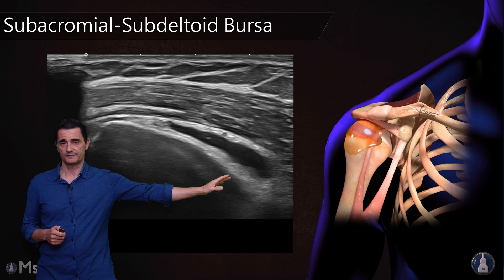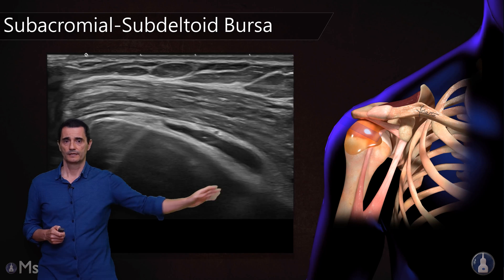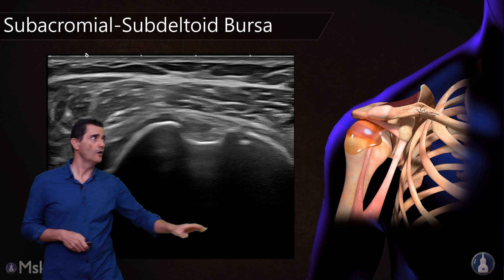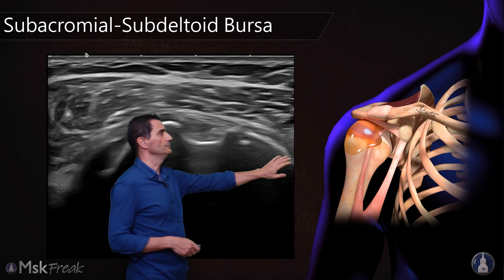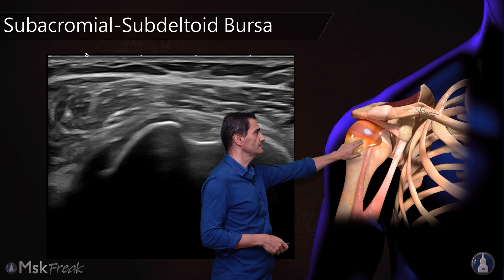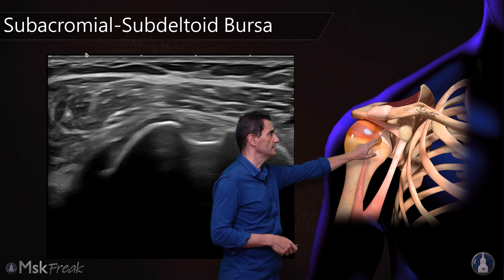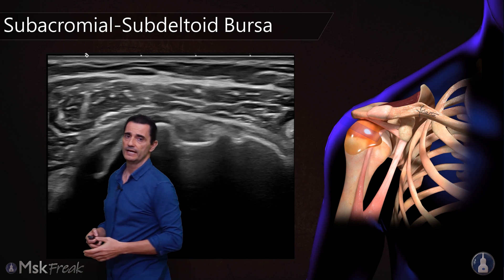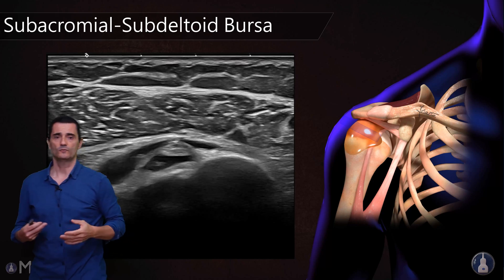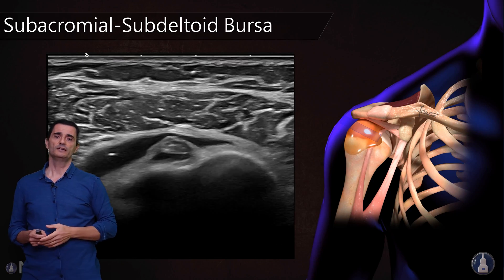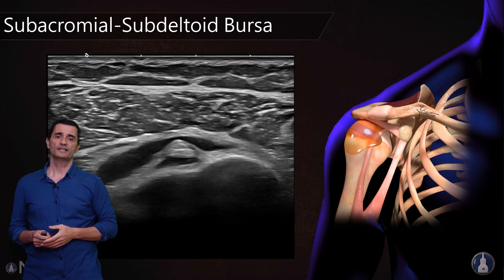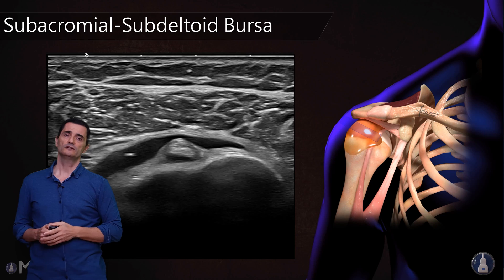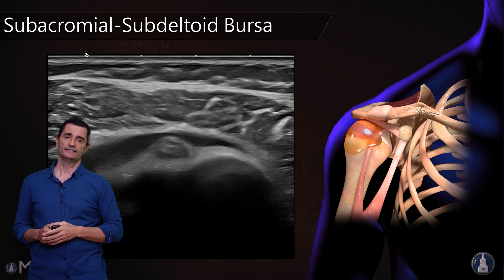This is a pathologic case. When we are anterior over the tendon of the long head of the biceps, remember that the bursa covers the long head of the biceps. We can see when there is effusion, this bursa reaching and covering this tendon of the long head of the biceps.